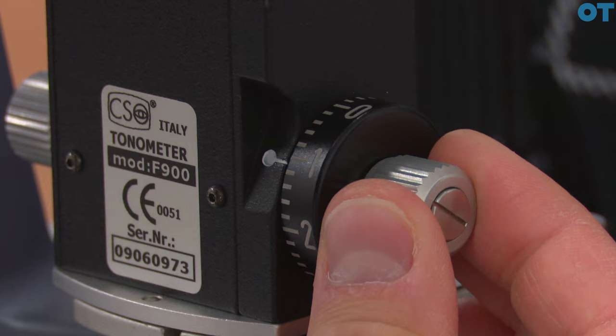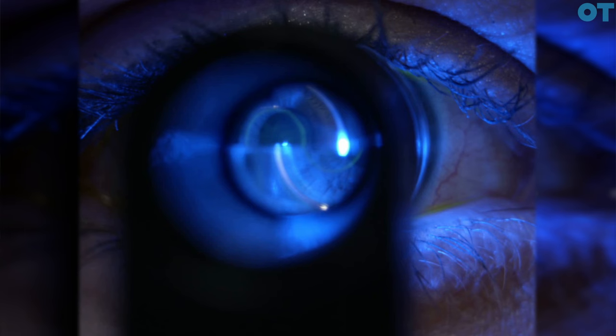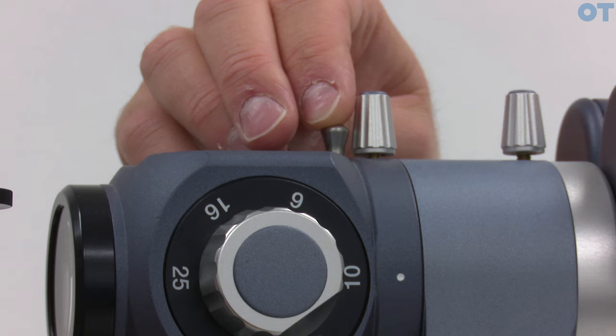We look down the instrument and rotate the dial until we get the inner aspects of the mires touching — we can increase the pressure too much, decrease it if insufficient, and then find that optimum point. To help with contrast of the image it may be useful to dim the room lighting and also introduce a Wratten filter or yellow filter, which will remove any unwanted stray blue light from the reflection from the surface of the cornea.